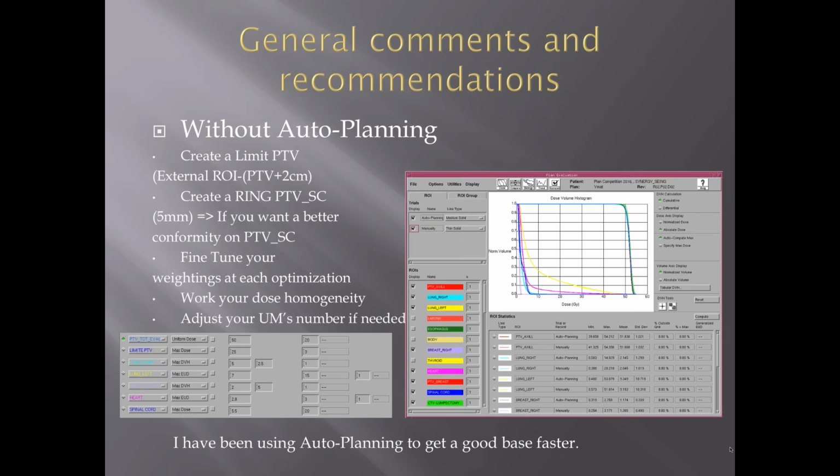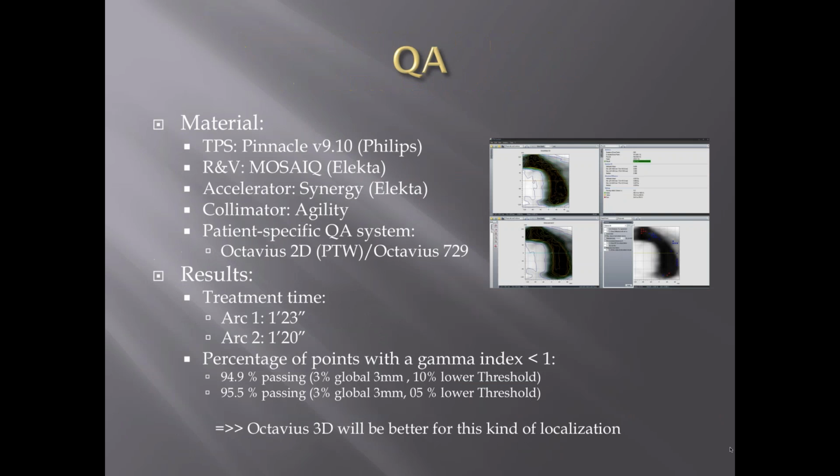So now my patient QA. I use a Mosaiq Record and Verify and an Elekta Synergy accelerator with Agility collimator. And for the QA system, it's Octavius 2D and Octavius 729 matrix.